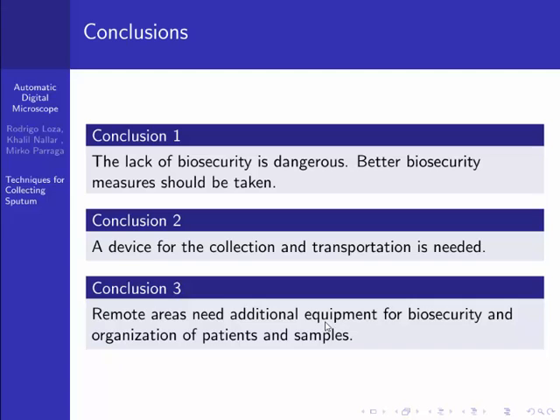We're planning on using an STM32F746. Nevertheless, this may increase the cost of our device, so we're not liking that idea too much. What we decided to do is to use a Bluetooth module, so you can use your cell phone to have control of the box and know how many samples, and the app will also allow you to classify patients in areas. It will be extremely useful.